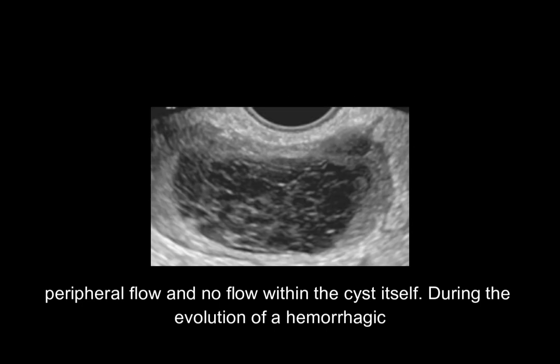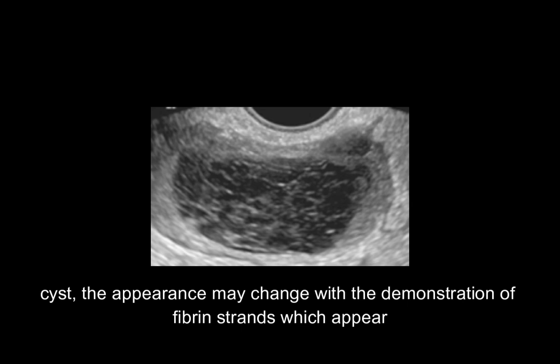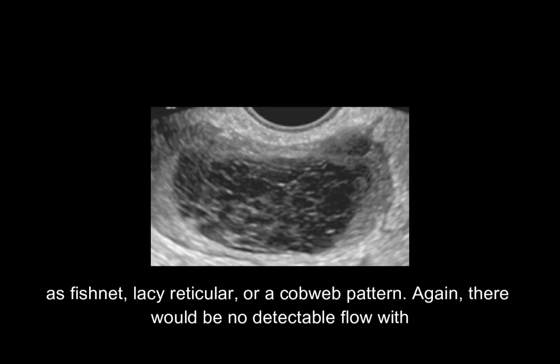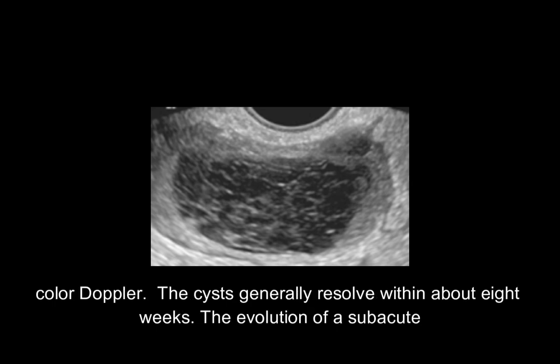During the evolution of a hemorrhagic cyst, the appearance may change with the demonstration of fibrin strands which appear as a fishnet, lacy reticular, or cobweb pattern. Again, there would be no detectable flow with color Doppler. The cysts generally resolve within about 8 weeks.